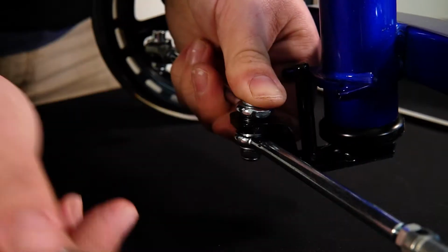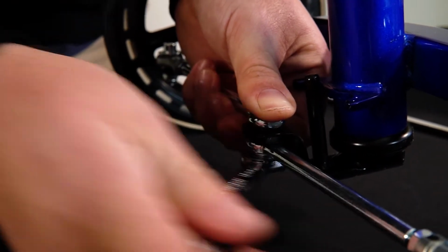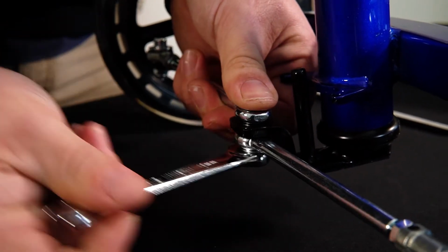You want to be sure to tighten this up where it's pretty snug, but not so snug that the steering is binding. So if your steering is binding, then you're going to want to back it off about half a turn.